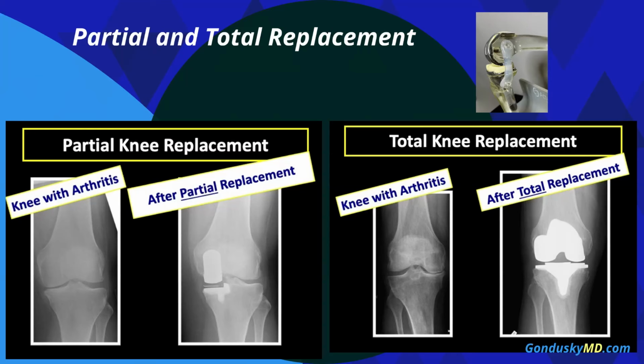Partial knee replacement in general is a little bit less invasive. There's smaller parts we're putting in, so incisions are smaller. It's a little bit easier recovery, and it's really a nice option for certain patient groups. But there's a lot of pros and cons to think about, which we will do in the office, in terms of your age, your activity level, your bone quality, your x-rays, and your arthritis locations. All these things really factor into the discussion about partial or total knee replacement.